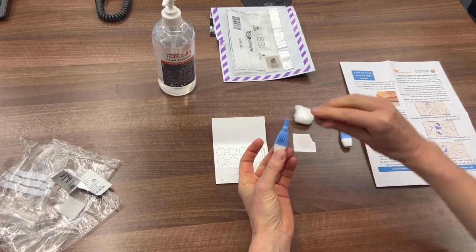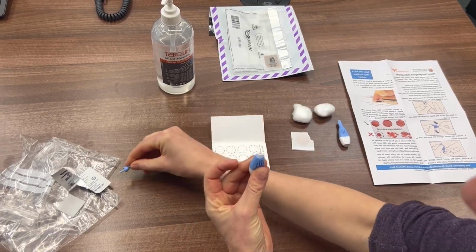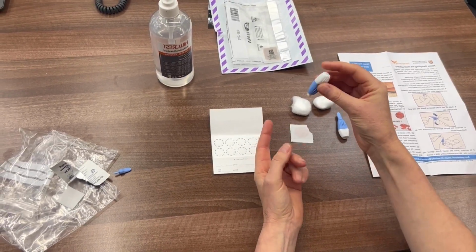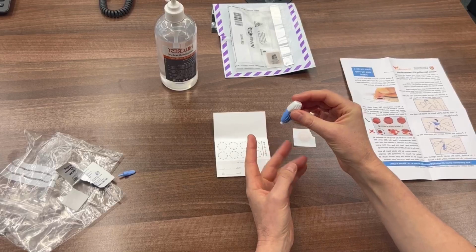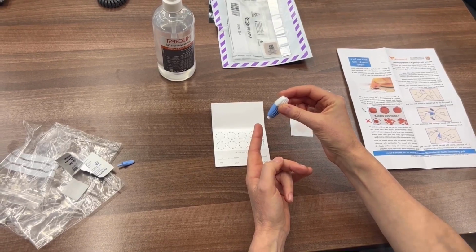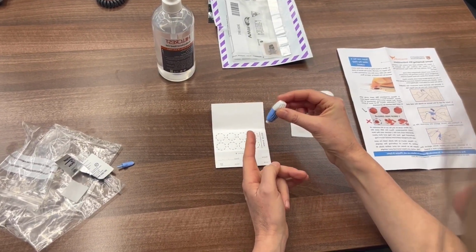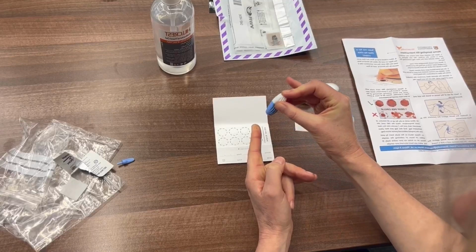So you then take the lancet and you twist off the lid. That can be put aside. You can see there's nothing visible at the moment, and that's because the lancet only comes out when you press. So just slightly on a side of the pulp of the finger, and there's an instruction for that if you're not quite sure in the paper information sheet. You then just put the lancet onto the finger and press through.